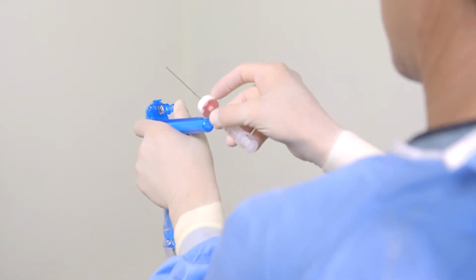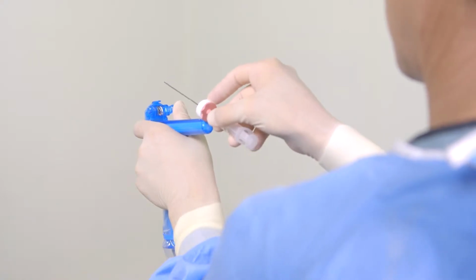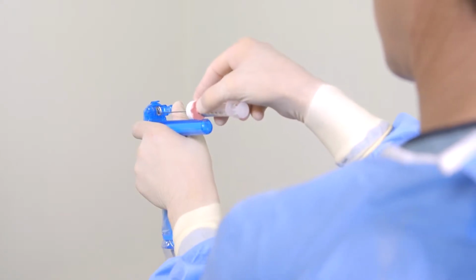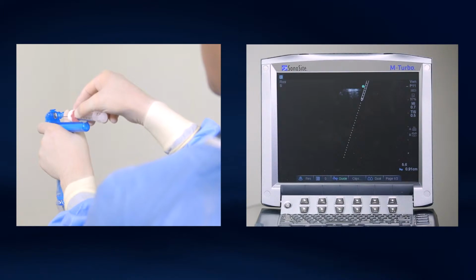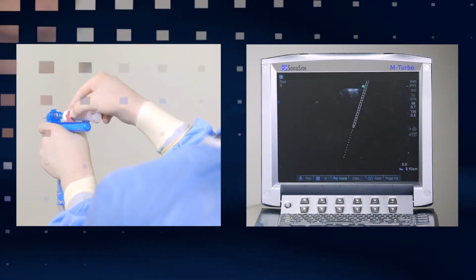Then, place the magnet against the proximal end of the magnet rail to stabilize the needle as you move the needle tip into alignment with the needle guide opening. To maintain needle sharpness, avoid hitting the needle tip against any surface as it is preloaded into the needle guide. With the needle in the guide, move the needle forward and backward. As you do this, confirm the needle movement is mirrored by the virtual needle movement on the sonogram.